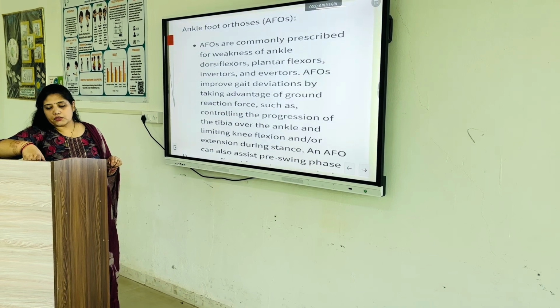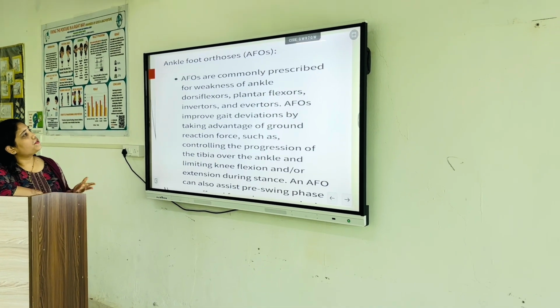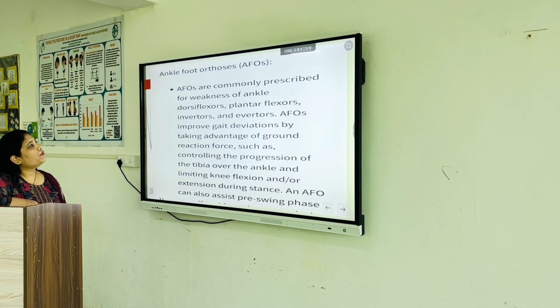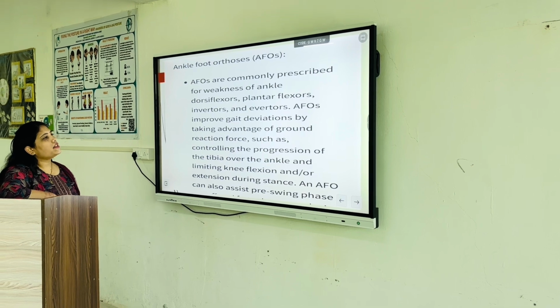This is lower limb orthosis. It's all about AFO. AFOs are commonly prescribed for weakness of ankle dorsiflexors, plantar flexors, inverters and everters.